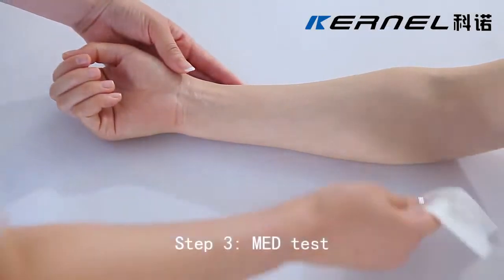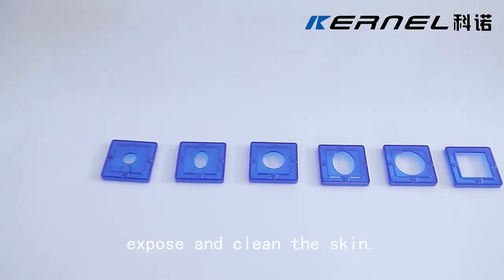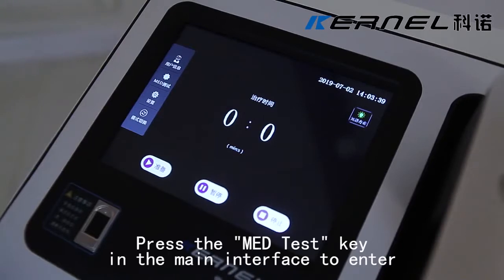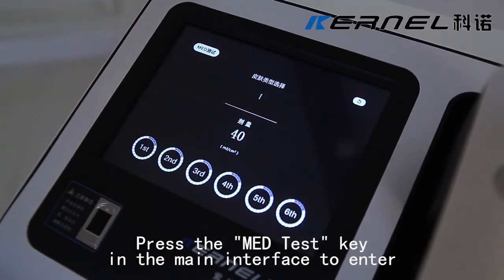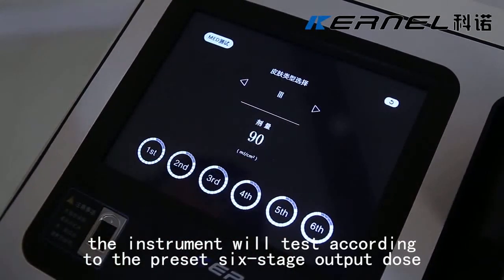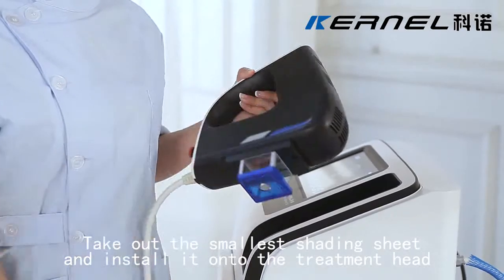Step 3: MED Test. New patients need to do the MED test to confirm the MED value. Expose and clean the skin. Press the MED test key in the main interface to enter. According to the selected skin type, the instrument will test according to the preset 6-stage output dose. Take out the smallest shading sheet and install it onto the treatment head.